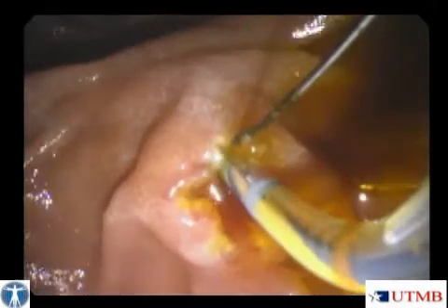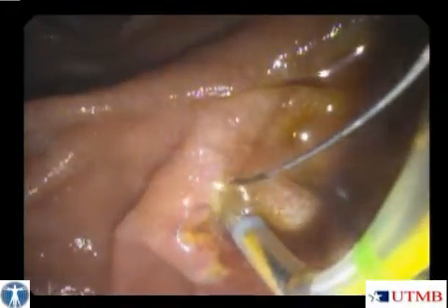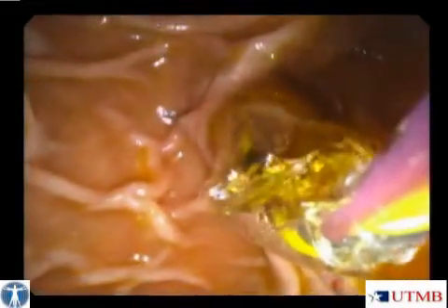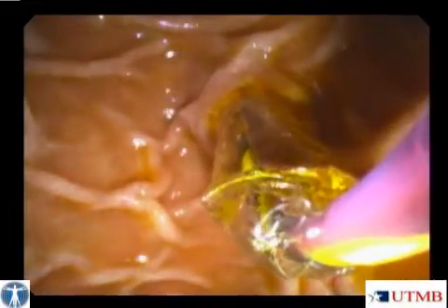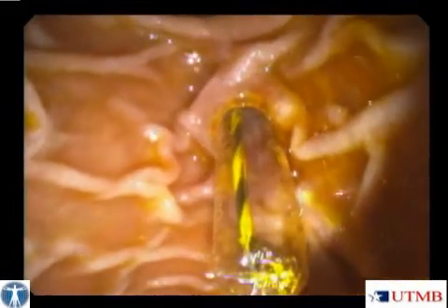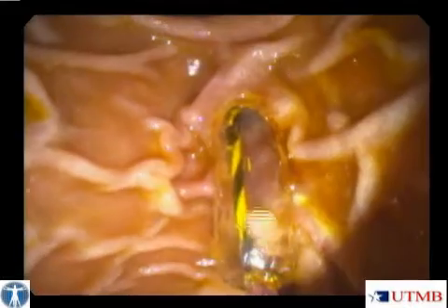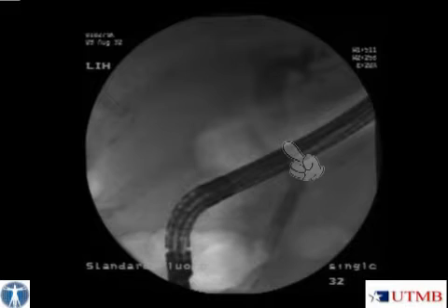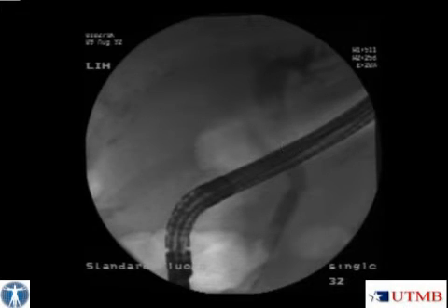Then, a small sphincterotomy was performed using endocut current. We then used a controlled radial expansion, or CRE, balloon to perform a biliary sphincteroplasty. We inflated the CRE balloon to 10 mm and kept it in position for approximately 30 seconds. On cholangiogram, it can be seen that the common bile duct stone has now descended slightly.